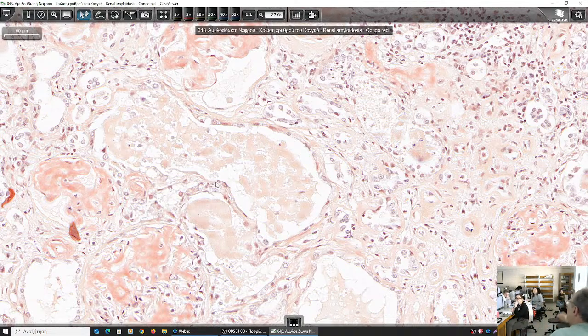As you have learned from your respective lesson, which is the main factor that causes atrophy to cells? There's not enough blood. And can you explain that in the context of amyloidosis?